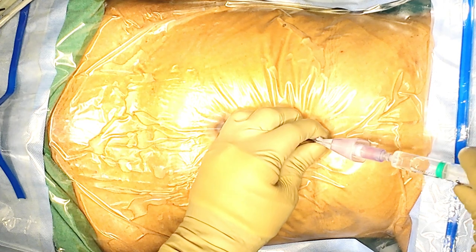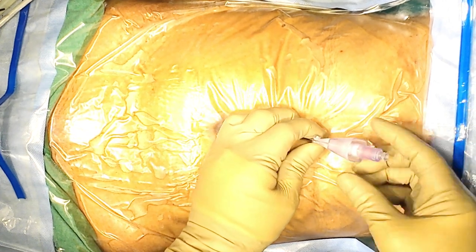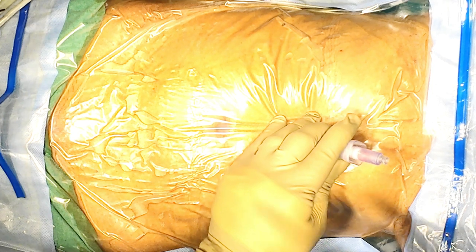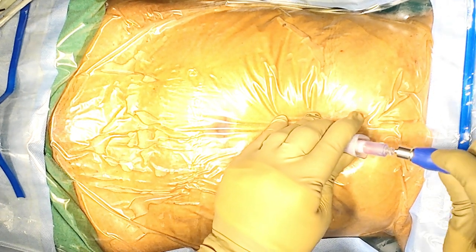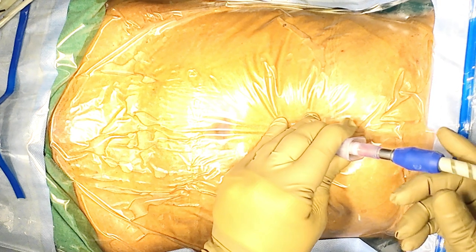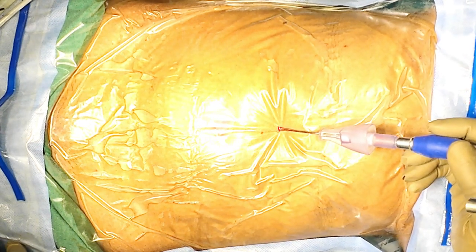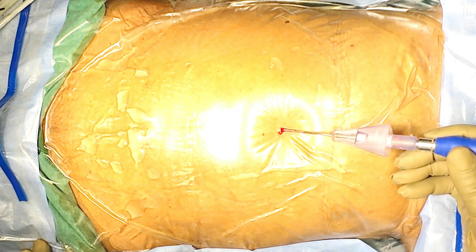The problem is that the radiologist has not clearly indicated whether it is an endometrioma, dermoid cyst, or a simple cyst. So we will take care that there should not be any spillage — we will use an endobag and perform the cystectomy inside the endobag.